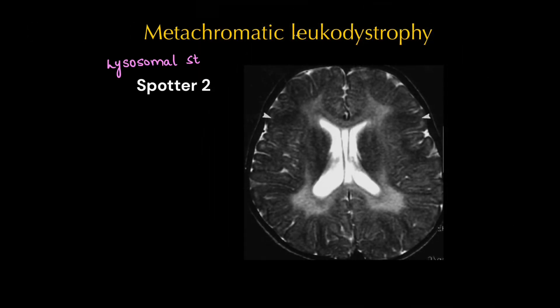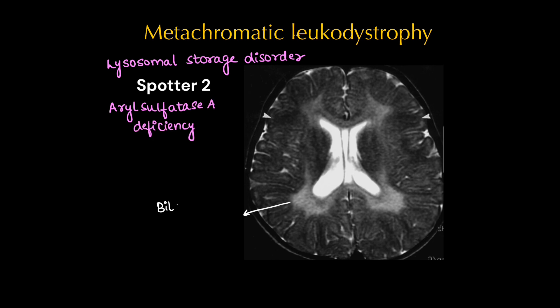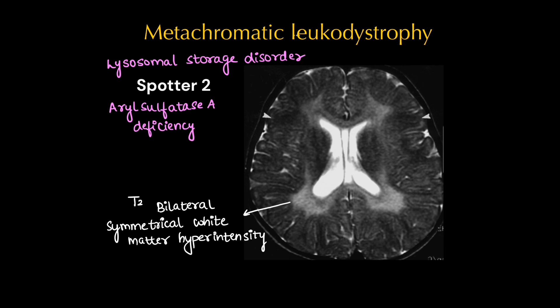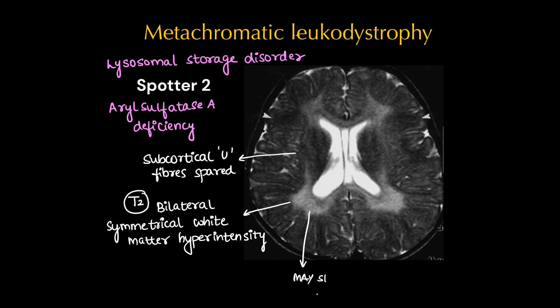This case is a white matter disorder known as metachromatic leukodystrophy, which is a lysosomal storage disorder where there will be deficiency of aryl sulfatase A. Here we can see bilateral symmetrical white matter hyperintensities on T2 weighted images. This will also show a tigroid pattern with sparing of subcortical U fibers — alternating hypo and hyperintensities.